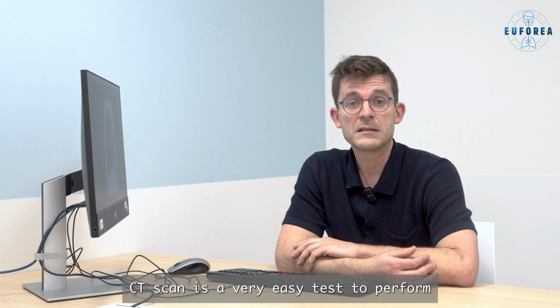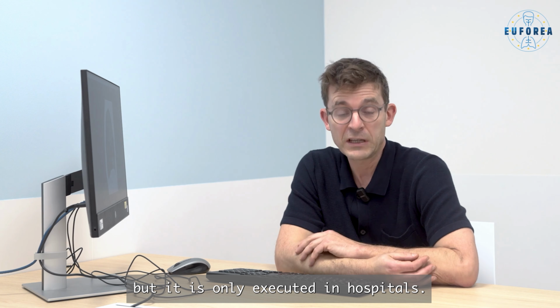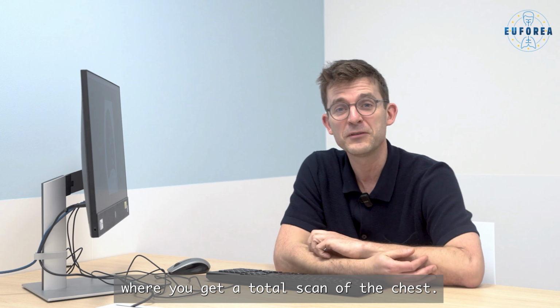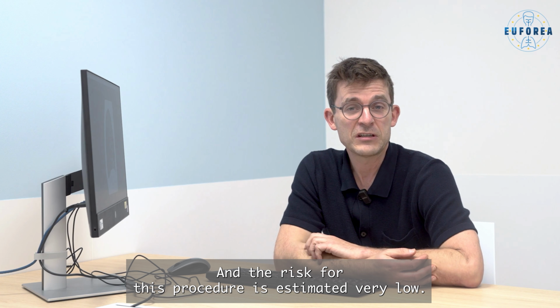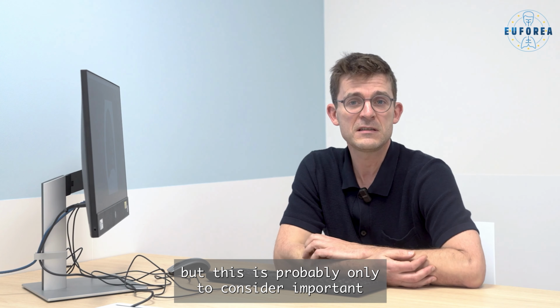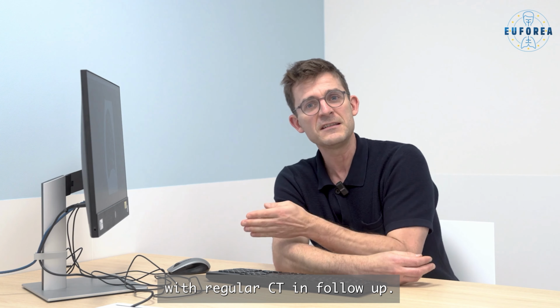CT scan is a very easy test to perform, but it's only executed in hospitals. The examination usually takes 5 minutes, where you get a total scan of the chest. And the risk for this procedure is estimated to be very low. There is irradiation exposure, but this is probably only important to consider with regular CTs in follow-up.